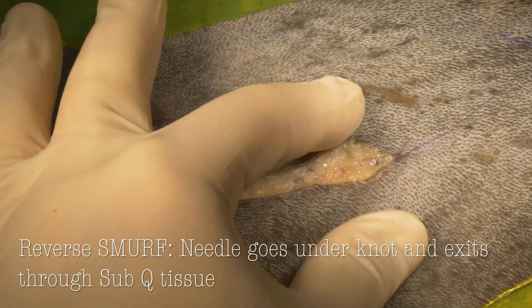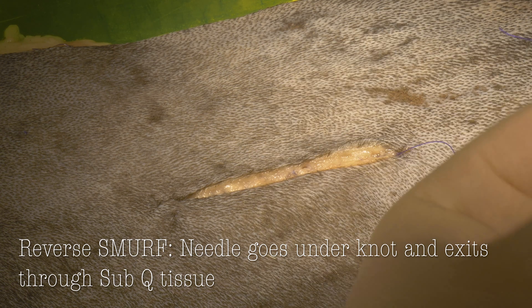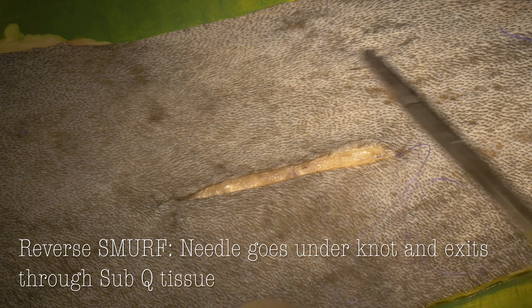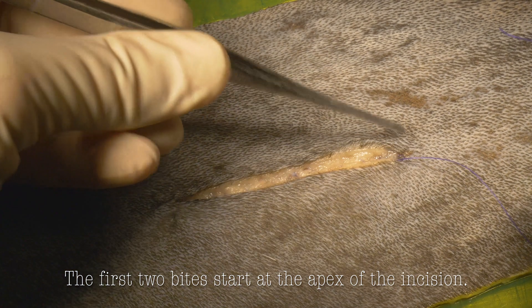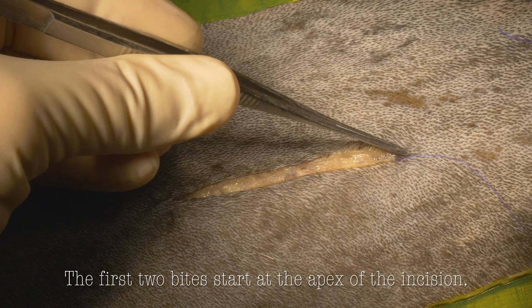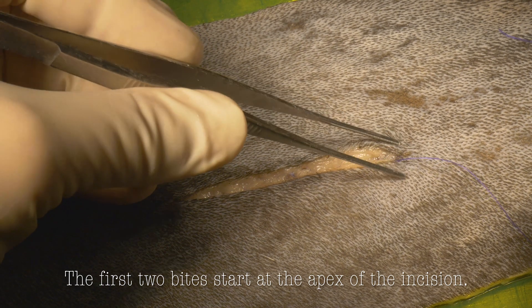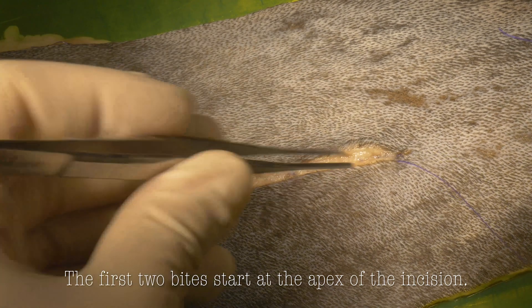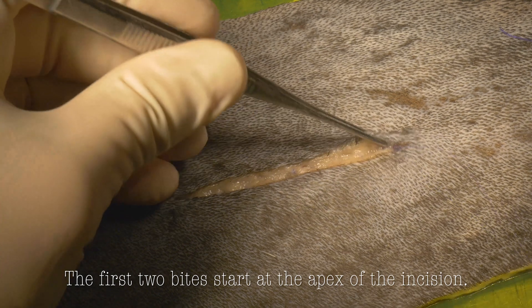The next step is to start our intradermal closure at the very end, or what I call the apex of the incision. For the first two bites, we're going to choke up on our needle to about half the length and do two small, exactly identical bites. I'll usually start on the far side, and then go back with 100% overlap on the near side, in order to pull those skin edges together over the buried knot. Afterwards, we can start our normal pattern of intradermal.